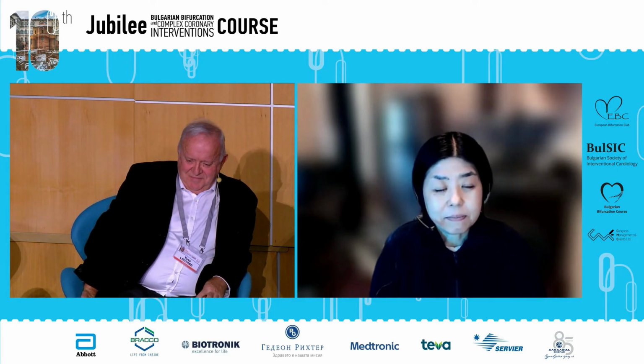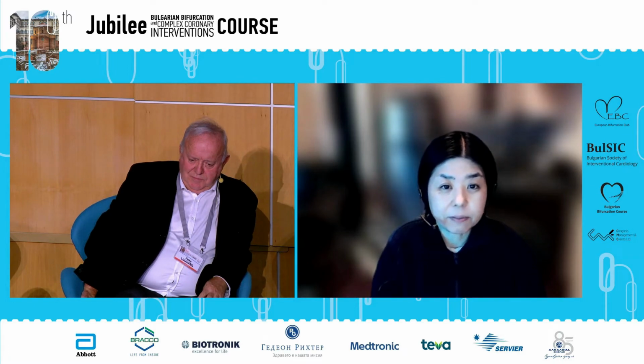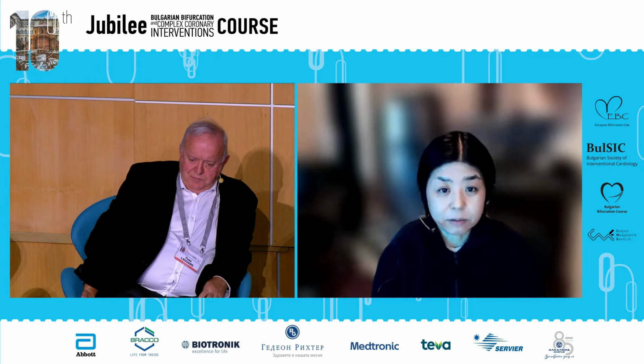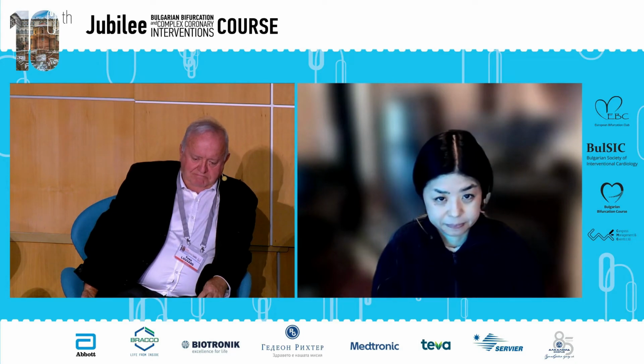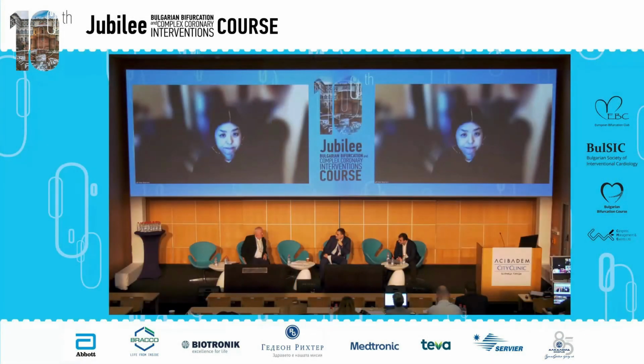But I don't think the normalization or making a different cutoff per person is possible because anyway, even the size is different in terms of the body surface. But still, left main is the biggest place in the coronary artery. So absolute area seems to work better. Okay, so we're pursuing absolute area without at the moment knowing what is the best.